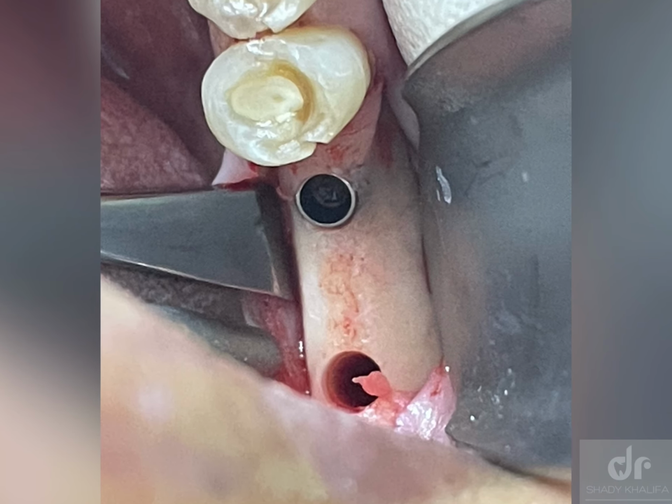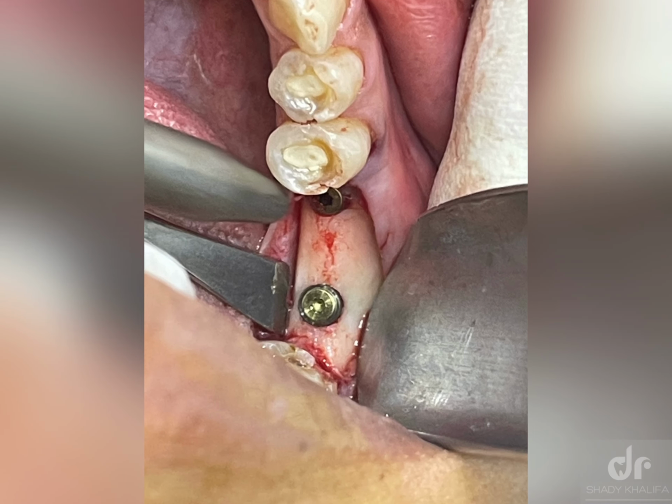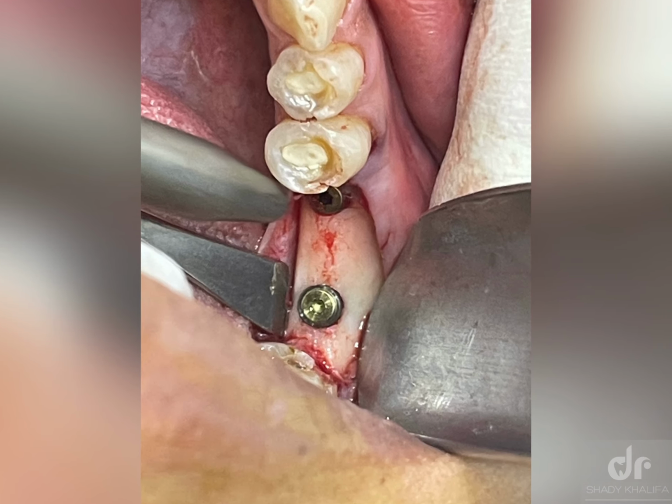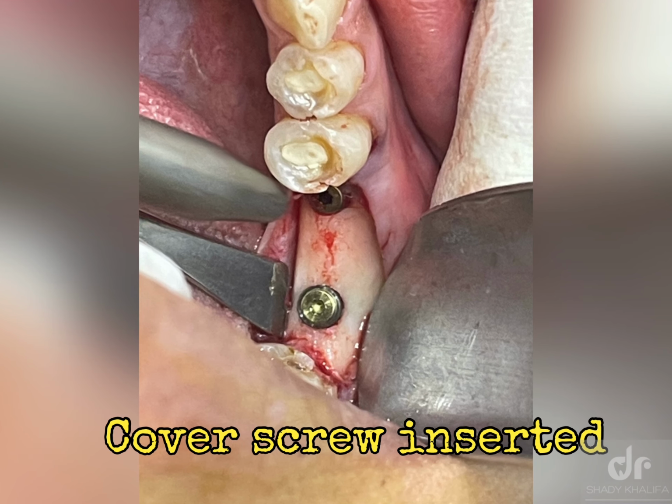Don't put it only flush with the bone. Put it apically 1 millimeter to 2 millimeters. It will be good aesthetically later.